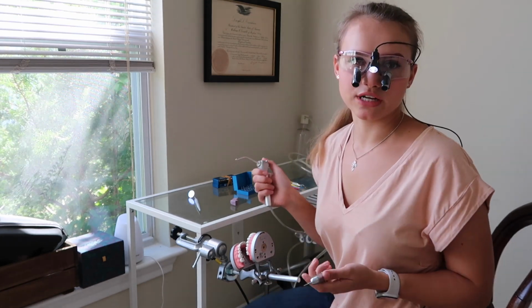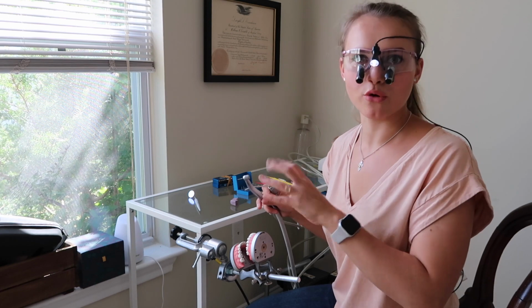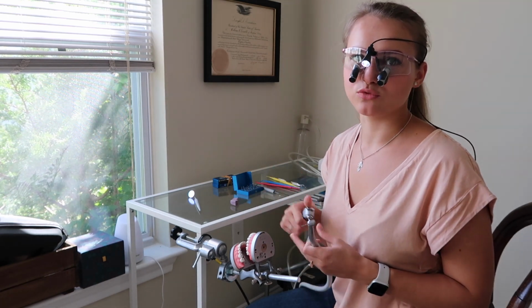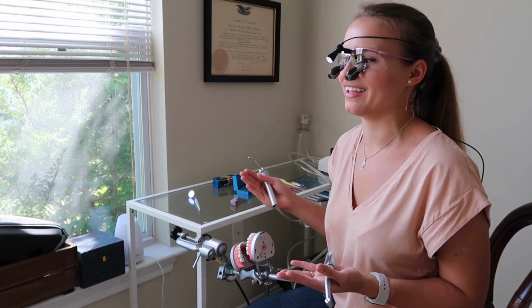So it's really helpful to have an air water syringe. Aside from my mechanic handpiece, which did not have an air water syringe, I would have to blow on my prep to remove all the plastic scraps. This is really helpful to use when I'm wearing a mask and I can't blow on my prep, and it's kind of weird to do because you would never do that in clinic.